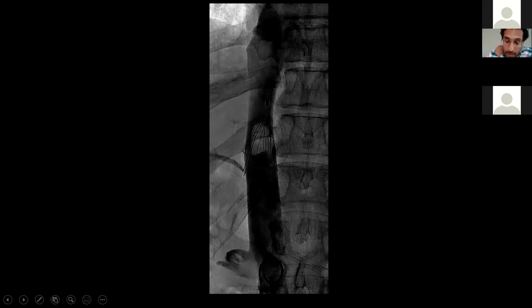Back to this case, we tried a trial of anticoagulation and brought the patient back in 3 months. I think a lot of people might say, why would you ever do that? I actually have cases that show that it does work, so it's a reasonable strategy. But in this situation, unfortunately, it was not, and this is what it looked like.